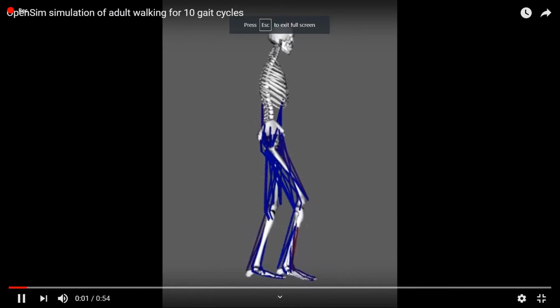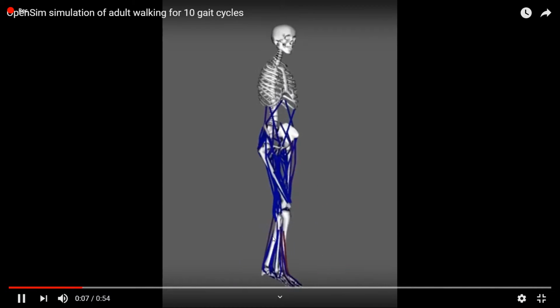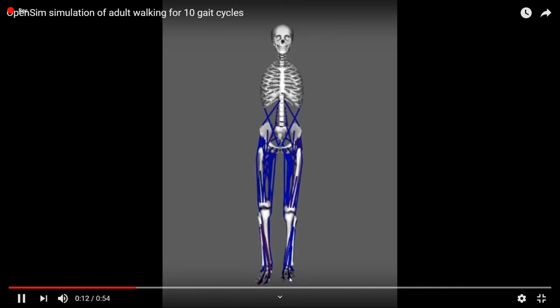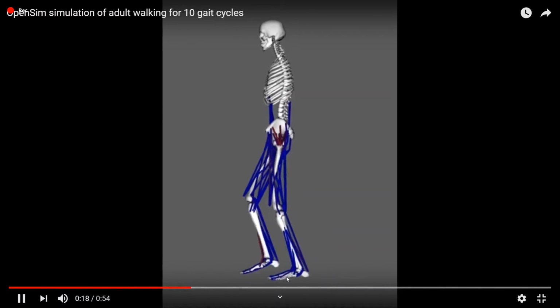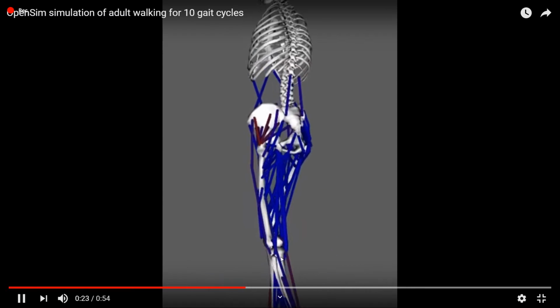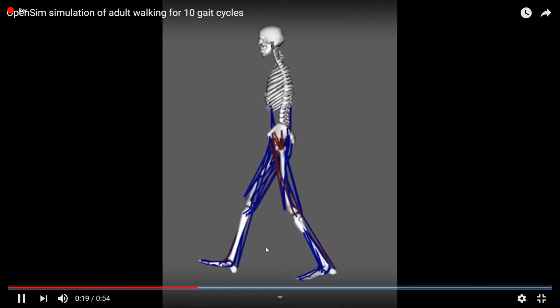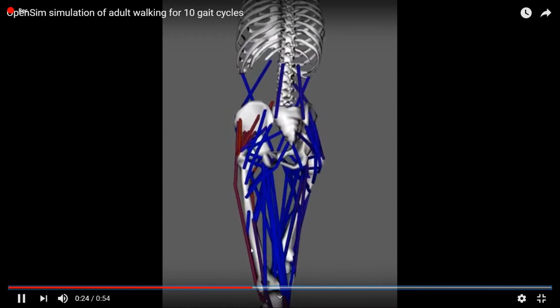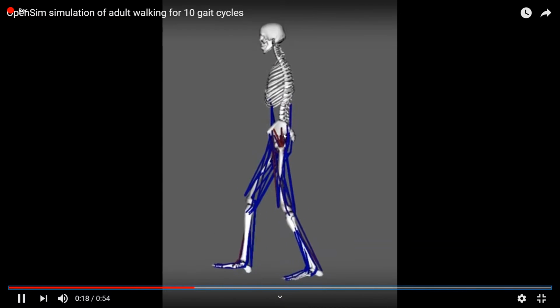Now we notice on this model performer, the foot lands and then the whole foot lands on the ground instead of just the pronating as we've seen with the subject. Now, if we look at the firing frequencies of the calf when it goes to move, only parts of it are firing at a time. This was almost replicated on our model performer, on our subject as well.